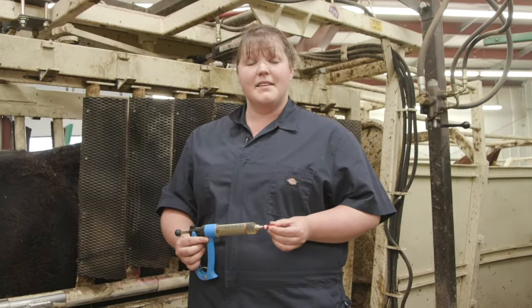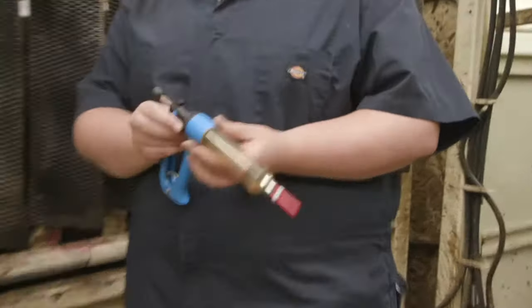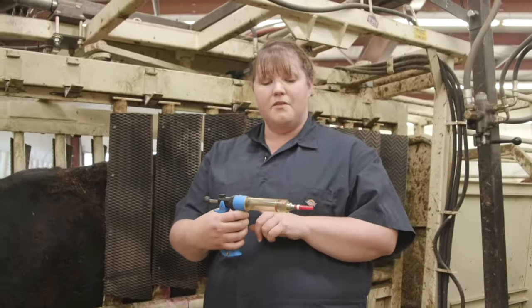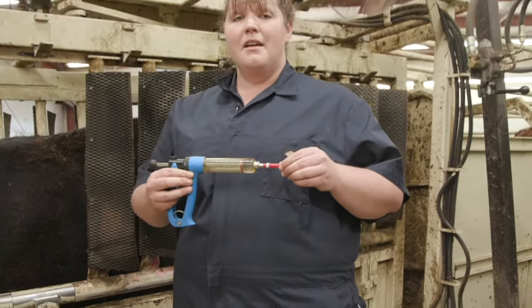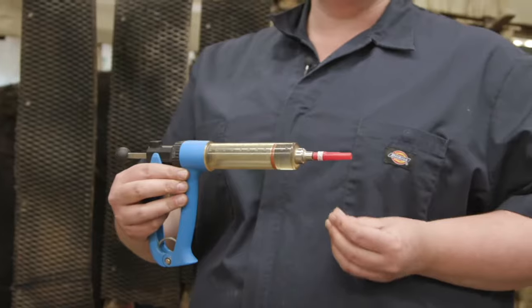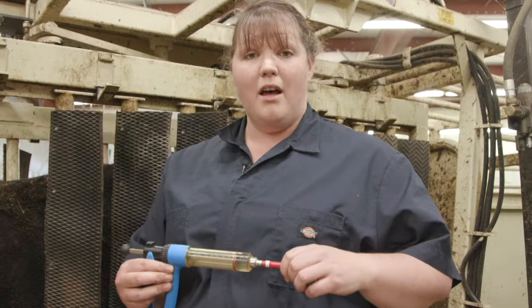Another alternative for giving your vaccines instead of a single syringe is using a multi-dose syringe. With a multi-dose syringe, you can actually set a volume to give your animal, and that will be set for every single animal — in this case, we're giving two mils per injection. You'll pull your trigger and it will administer the full volume set. With your needles, you're able to use them for 10 to 15 animals before changing. However, if you ever bend a needle, it breaks off, or it feels dull or has a burr on it, stop and change your needle. Also, when you go to reload your syringe, change to a fresh needle before putting the needle back into your drug or vaccine.